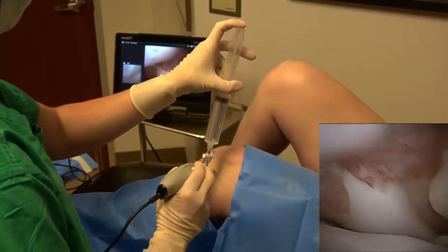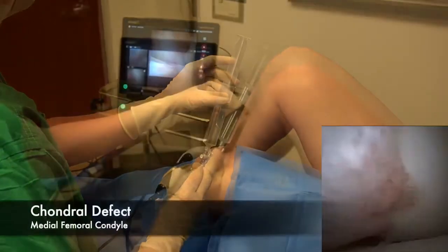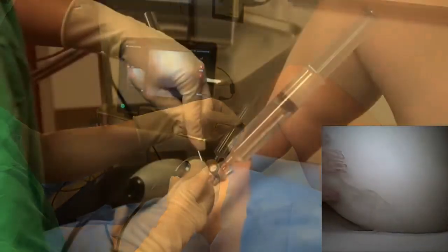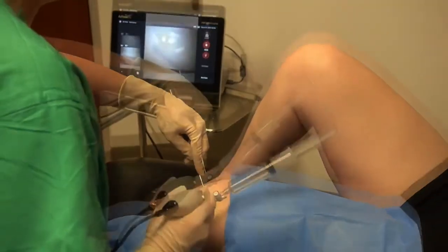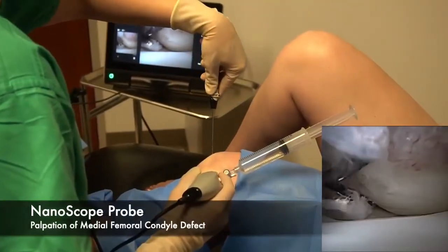Perform a diagnostic knee arthroscopy to identify and assess any intra-articular pathology. In this particular patient, a medial femoral condyle defect is identified. If needed, a 2.0 mm nanoprobe or other nanoscope instrumentation can be used for both diagnostic and therapeutic treatment.